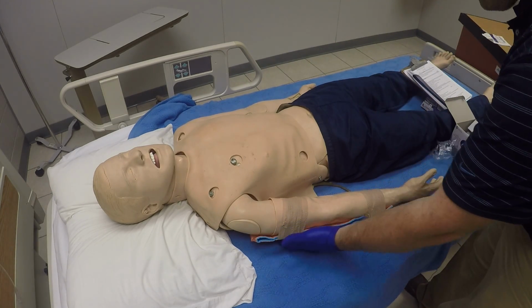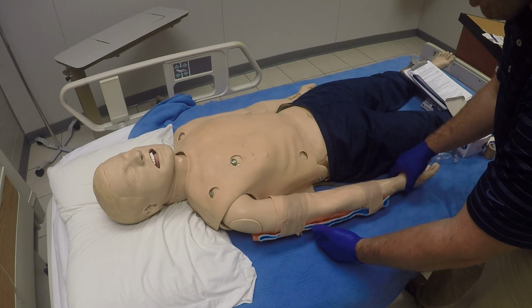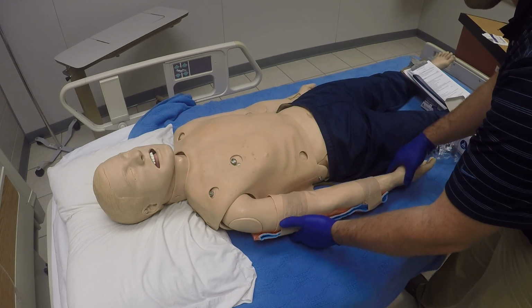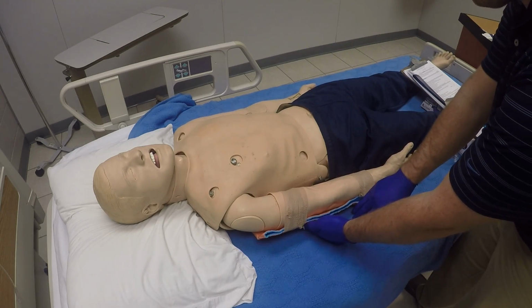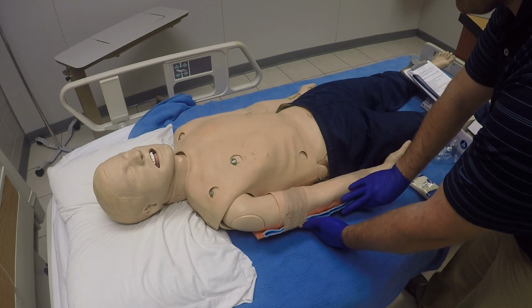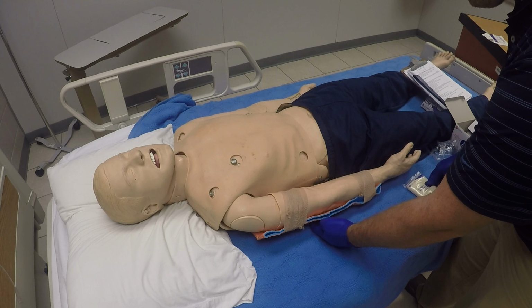Once that extremity has been immobilized, the joint is immobilized and everything's secured, you're going to want to go ahead and secure that to the body if at all possible. If we're on a backboard, we can go ahead and secure that arm and strap that arm down. We can use our triangle bandage here to go all the way around the abdomen and secure that arm to the abdomen and chest. If we need to do that, we'll do it.